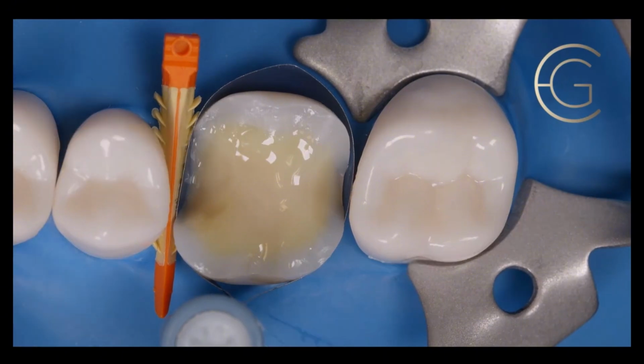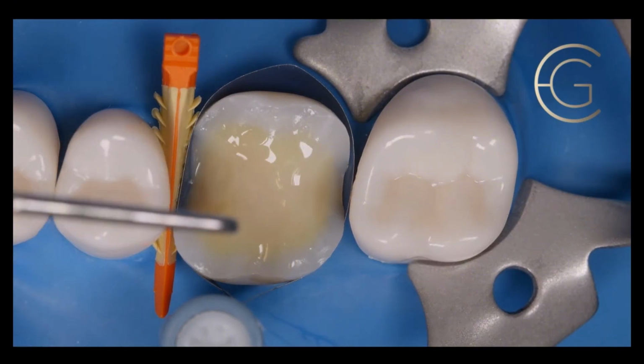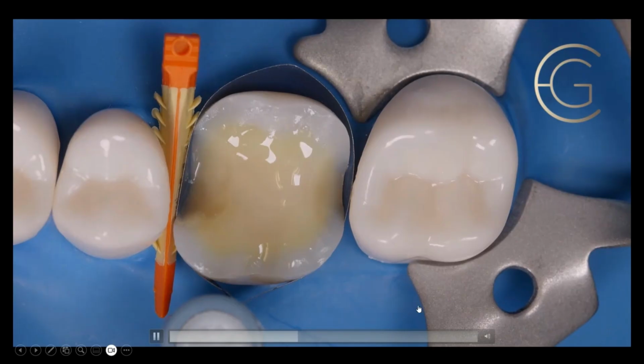But now I'm just spreading this around. Again, I could have been done. Now I'm checking it, I'm spreading it, and I'm going to cure this. This cures for 20 seconds. And then we're going to move on here.